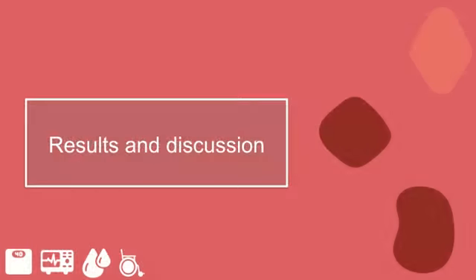In this experiment, we did blood type testing considering how the blood would change when it was mixed with each antibody: anti-A, anti-B, anti-AB, and we indicated from the change what blood type it was. The change happened because of antibody cross-linkages established when one antibody reacts with antigen on two different red cells.